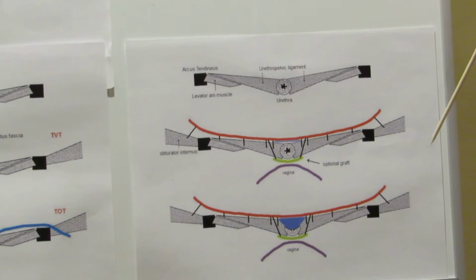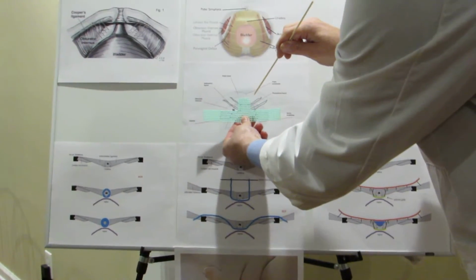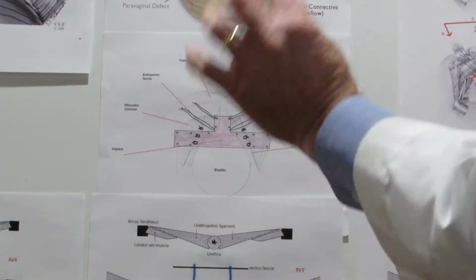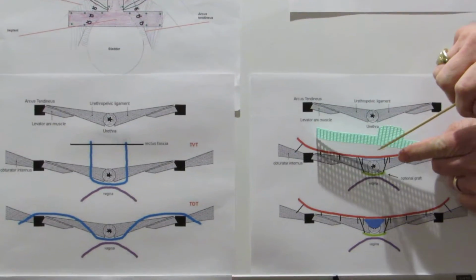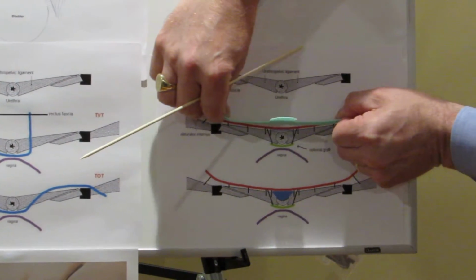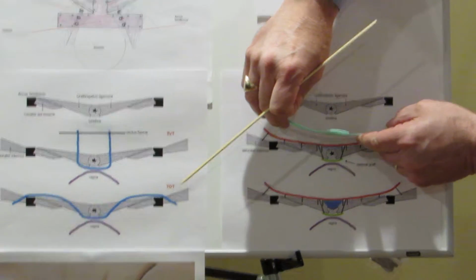These are not trocars. And basically underneath this device is an expandable member. So underneath this device, which would push posterior, is an expandable member, not shown on this diagram here. But basically shown as a thin line here. This is the deflated position. But if you place this into the pelvis, creating a fixed plane of support, continuity of all these fascial planes together, repairs, reduction, just like you would repair a hernia.